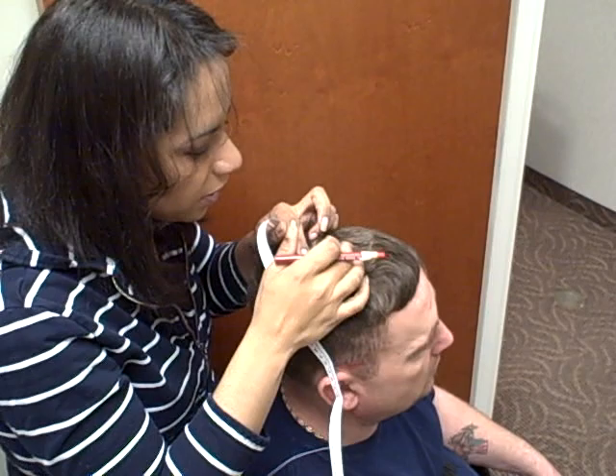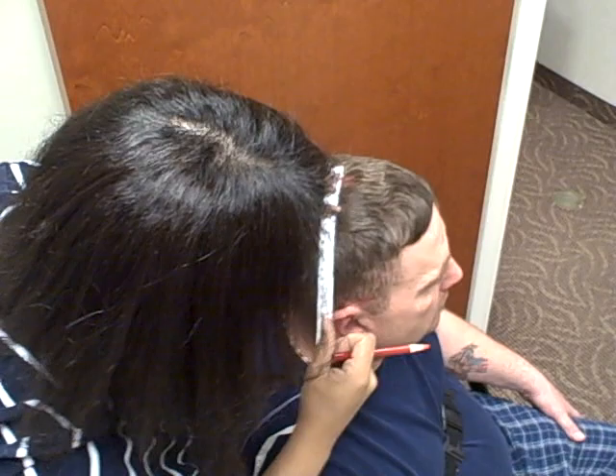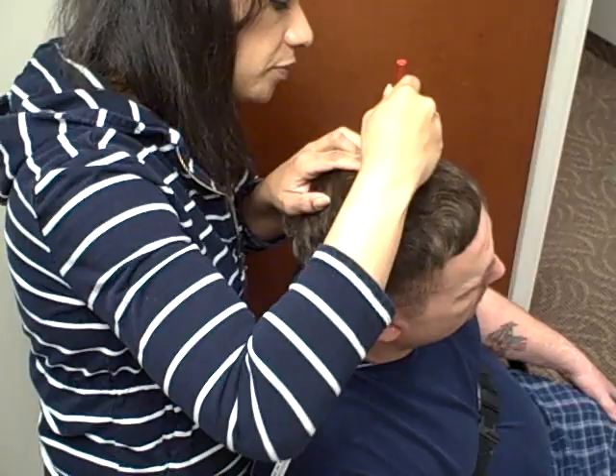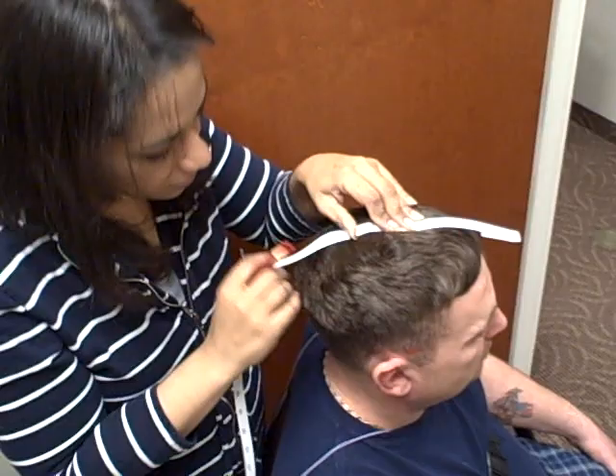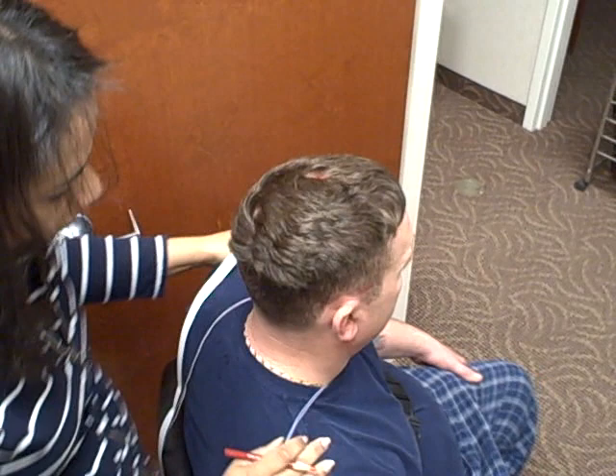The X that I made here — that you can see — that X is our CZ. I'm going to extend this line straight down so I'll have a cross intersection when I measure for my C electrodes. I'm also going to extend that same front-to-back line down so I have a center point when I go to measure for my O electrodes.